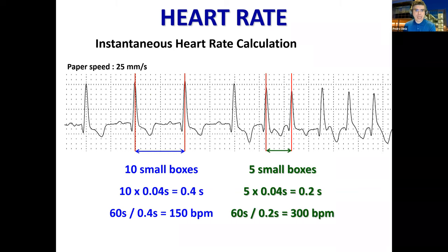In this ECG the heart rate speeds up. We can see now that we have half the number of boxes compared to the first interval — just 5 little boxes between one R wave and the next. So we multiply 0.04 by 5, which equals 0.2 seconds, and then divide 60 by 0.2 seconds to get an instantaneous heart rate of 300 beats per minute.